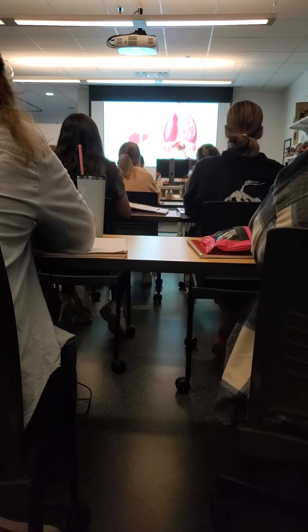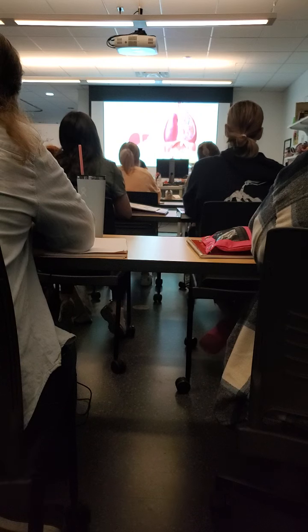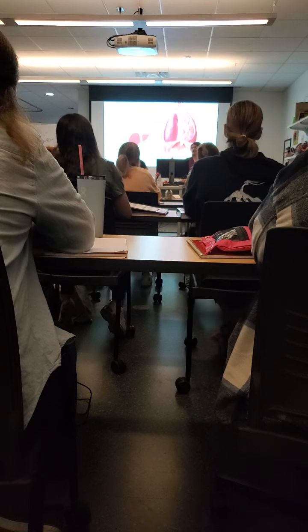Okay, and as a visual for you guys, kind of your 3D a little bit for you here, Connor. This is your diaphragm, right? And so if we tuck that liver right into that pocket, we can already tell that the right lobe, we're going to see a little bit here anteriorly, but we're going to see a lot posterior, right? And we'll see some superiorly. And you guys will see that on ultrasound because it's very echogenic, okay?